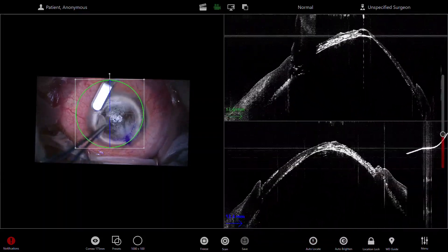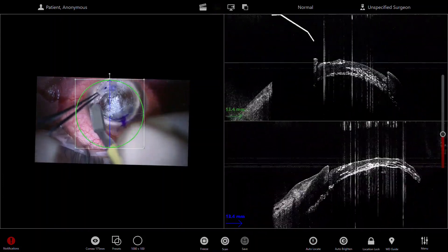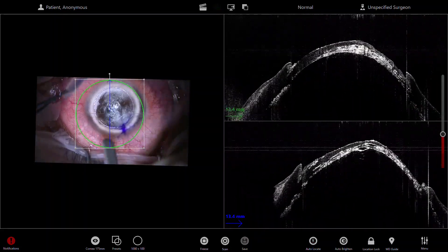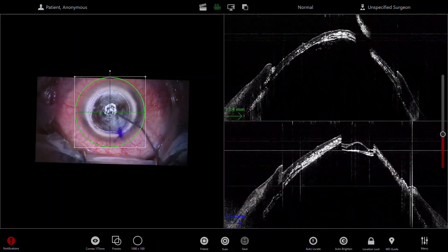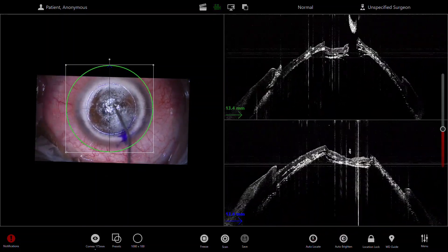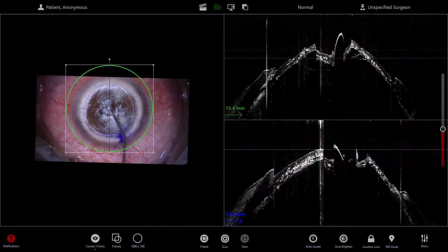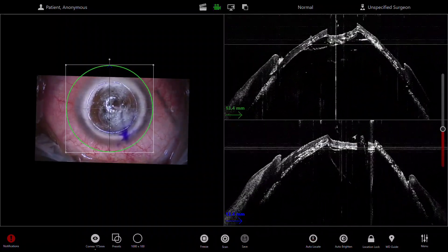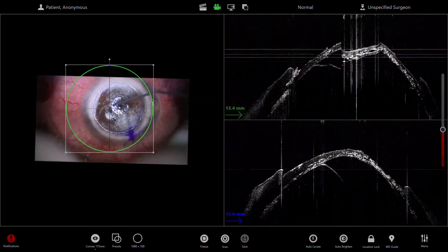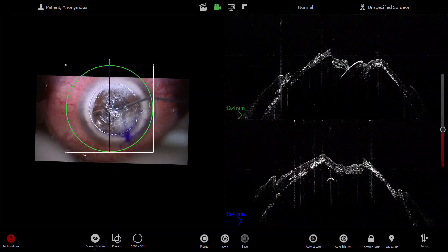Here you can see how much stroma is left despite removing the anterior cap — there's a lot of stroma still remaining, but you have a big bubble here so it's not so important. I put a blob of viscoelastic on top before I do the slash, and here you can see the slash into the anterior stroma to release the gas. You can see the viscoelastic spreading the interface, and you can see that the Descemet's membrane is being pushed backwards — you can see the Descemet's membrane quite nicely here. I'm just injecting a bit more viscoelastic into the space.